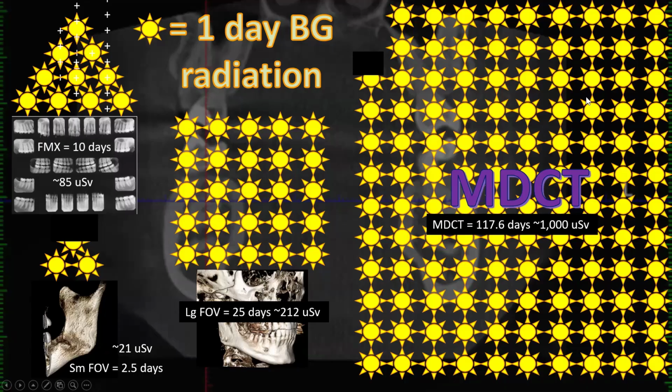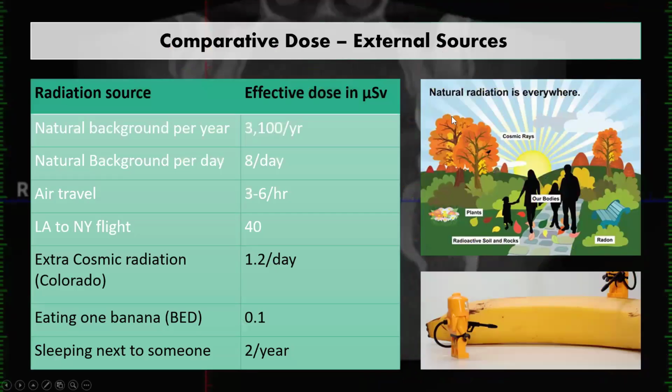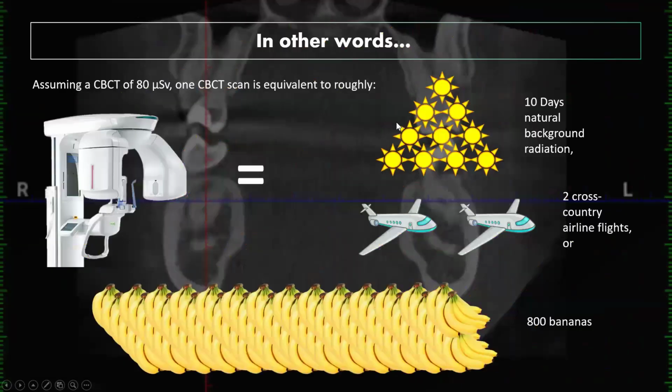Compare that to the daily background dose of a medical CT, specifically a head CT, because as I mentioned just yesterday, abdominal CTs and other types of CTs can be a lot more. But this, I think, is getting more significant when you're around the order of hundreds, over 100 days of natural background radiation. And remember these other things you can compare to? I know we've gone over that, so I'll just skip through.